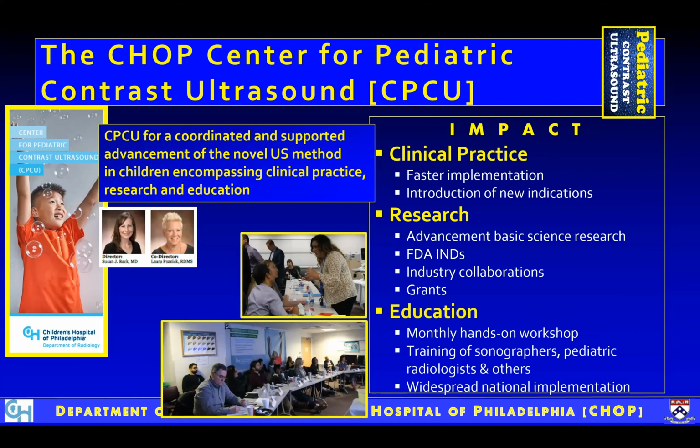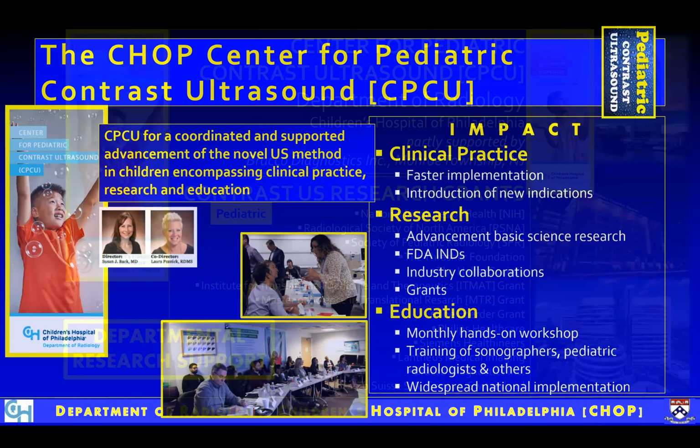In addition to these, we conduct, before the COVID time, a monthly hands-on workshop, and we were able to train over 200 colleagues and support more than 40 pediatric hospitals in the United States to start a pediatric contrast ultrasound service.